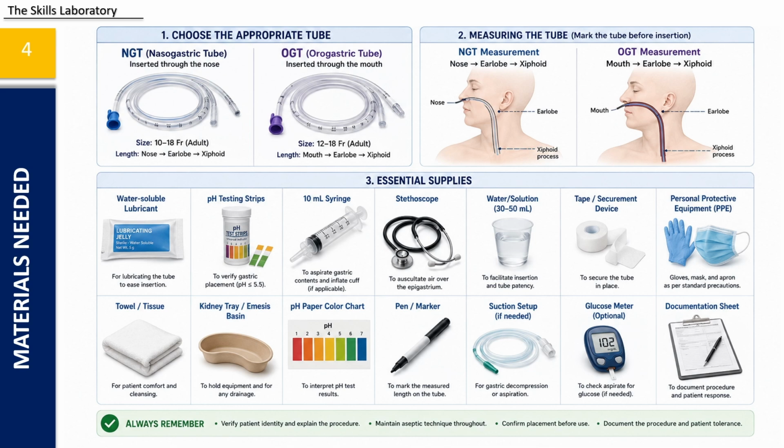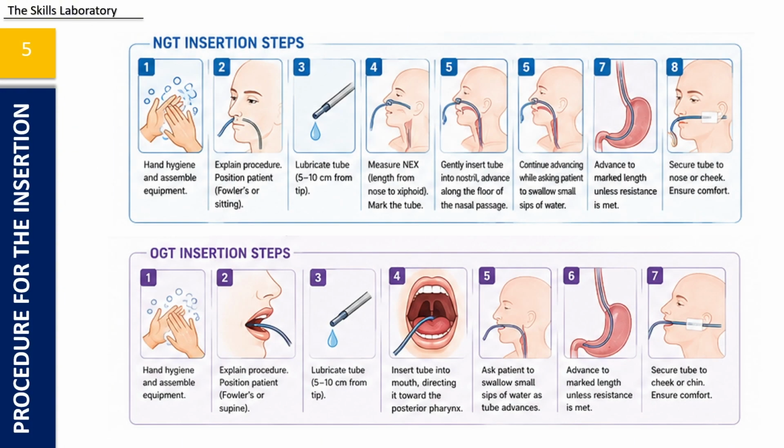Marker, we don't usually use this unless we label the parts or areas. And those are the important materials that we need for the NGT and OGT insertion. Okay, now let's go to the procedure.